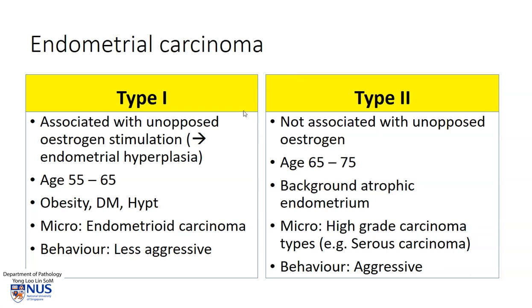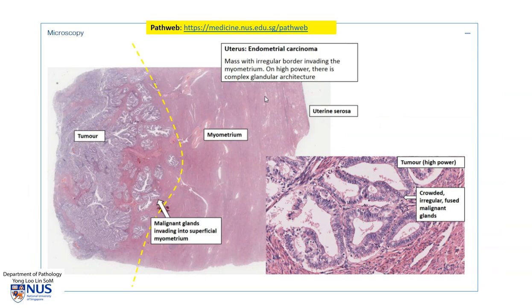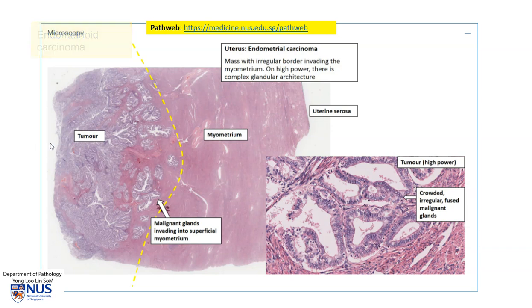Here is an example of endometrioid endometrial carcinoma under the microscope. We can see tightly packed glands which are quite branching, towards the endometrial cavity, and here is the myometrium — so these glands are actually invading into the myometrium. At higher magnification, these are the malignant glands and we can see the cells are quite columnar with rather elongated nuclei, but it looks relatively well differentiated with not a great deal of nuclear pleomorphism. These glands are directly sitting in the myometrium, hence there is myometrial invasion.